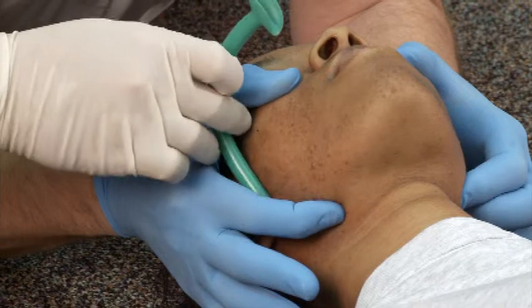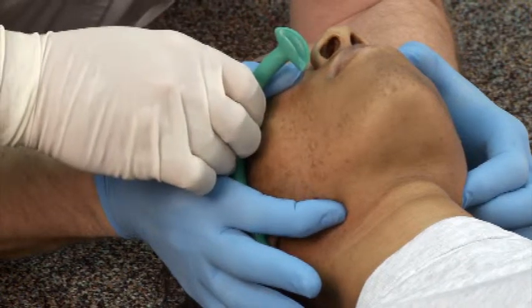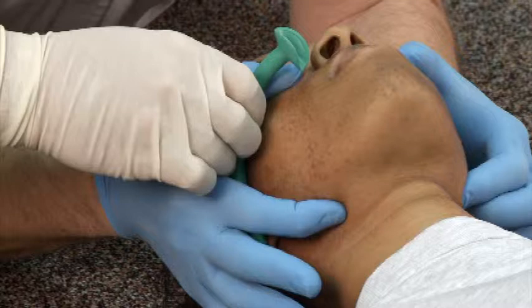The length of the NPA is important. It must be long enough to supply an air passage between the patient's tongue and posterior pharynx. An acceptable method for measuring the NPA for proper length is to use the distance from the patient's nose to the earlobe.